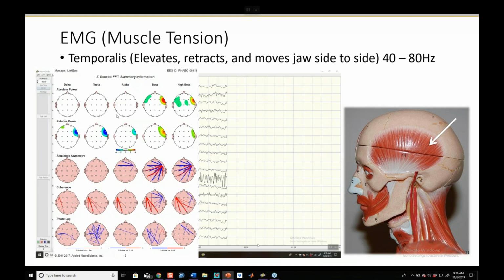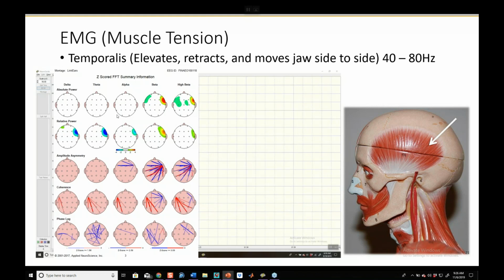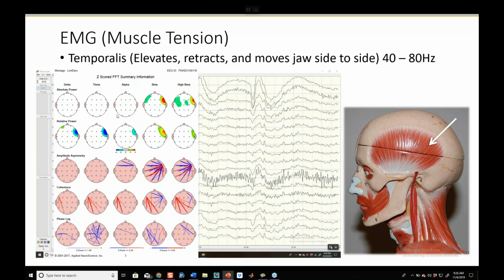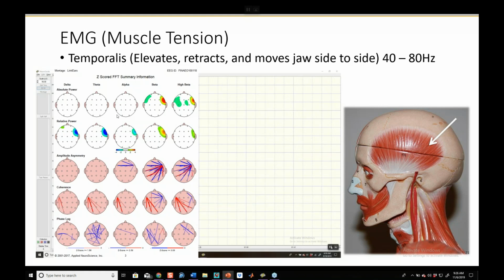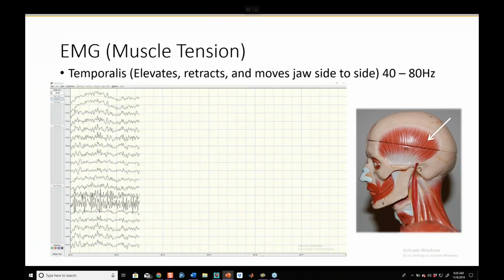beta. Same thing, right? We look at relative power, we say, oh, there's a deficit in delta and theta. That's due to the excess in relative beta. And the amplitude asymmetry is a reflection of the power differential at that site, as is the hypocoherence at F8 as well. That F8 is going to look something like this in your spectra, where he's running alone. So beware, be suspicious of the solitary electrode.